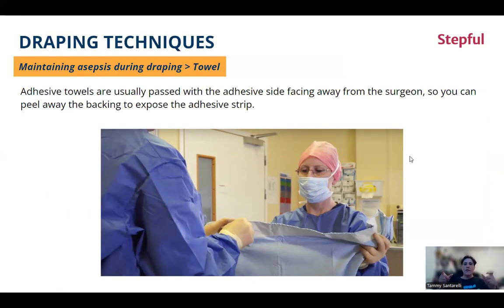So you would lay out your 4 towels with the sticky on your back table, right on top of each other, and peel off the sticky. And hurry up and pass one at a time, get back to your table, grab another one and another one. That saves time in the long run, and your surgeon isn't there tapping his or her foot saying, come on, we're just draping.